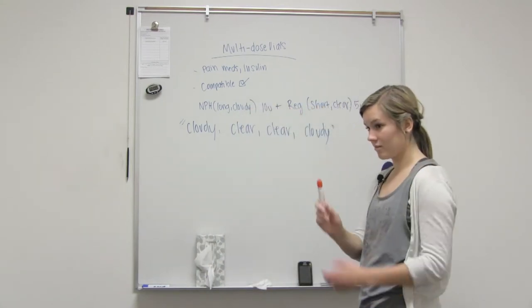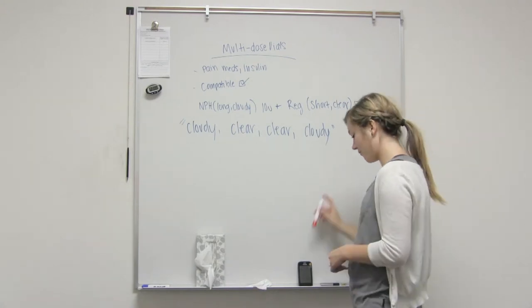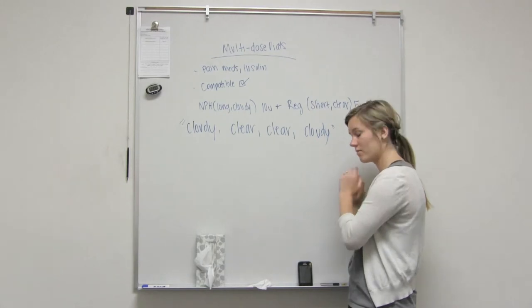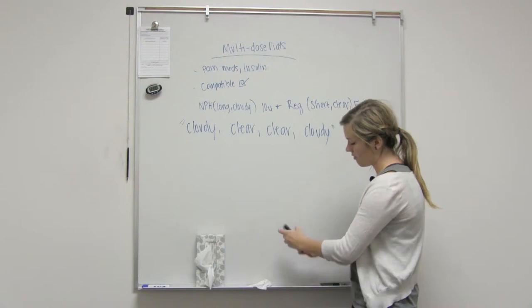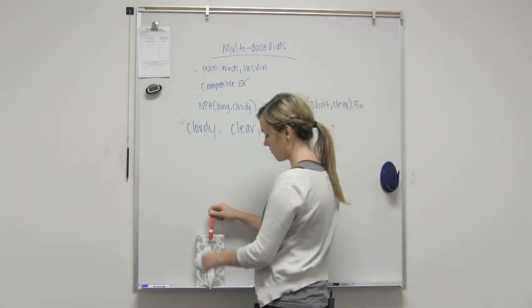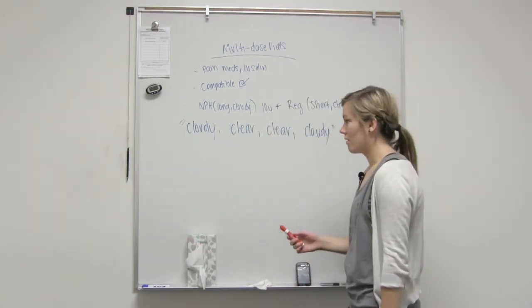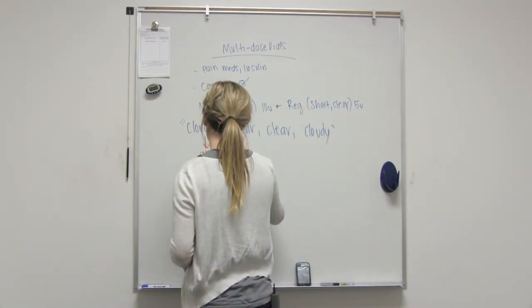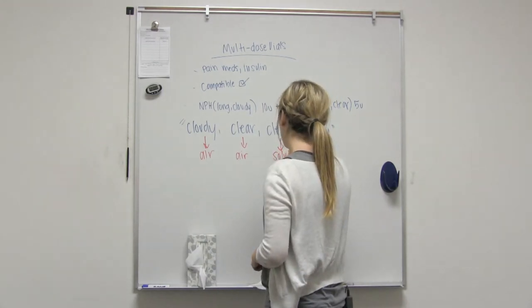Then you're going to take your other needle. Draw up 5 units of air, draw it into the regular vial. So now both of these have the amount of air that they need to take out of solution. You just drew in 5 units of air, and you're going to get 5 units of regular. So this is good. Then you go into the cloudy and take out 10 units of NPH. You put in air first, and you draw up the clear solution first, and then the cloudy solution.